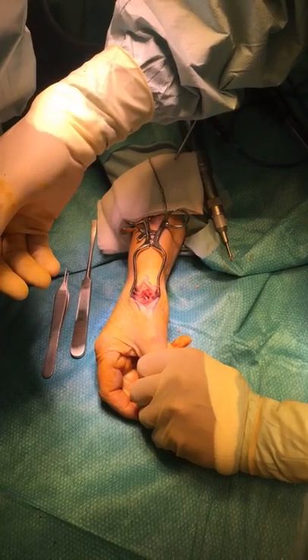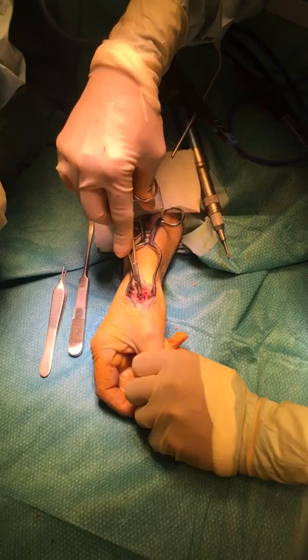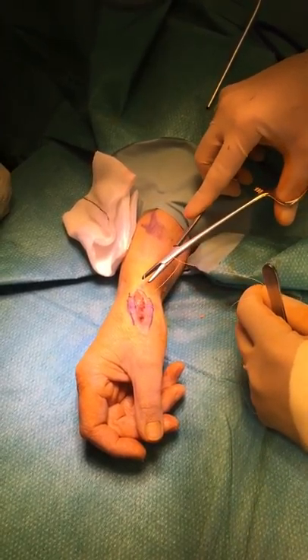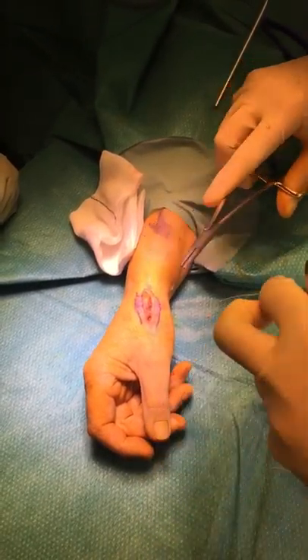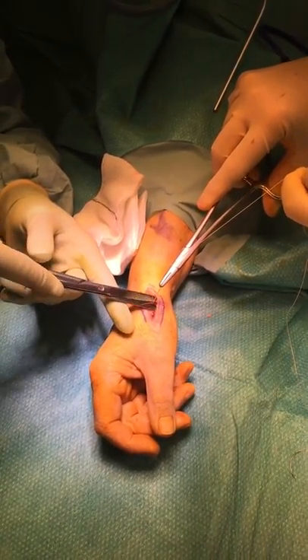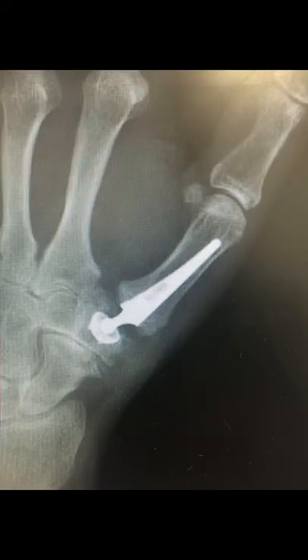A little tap on the head secures it in place. The joint is then reduced and the wound is closed with sutures using Vicryl.